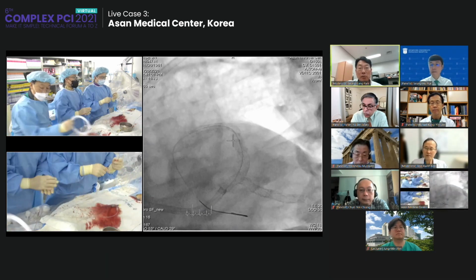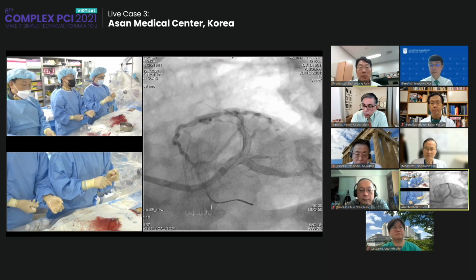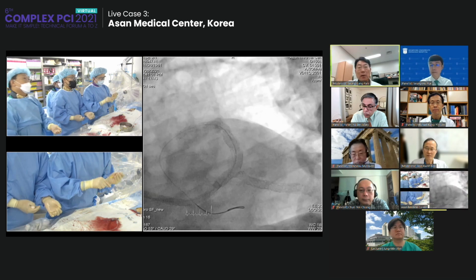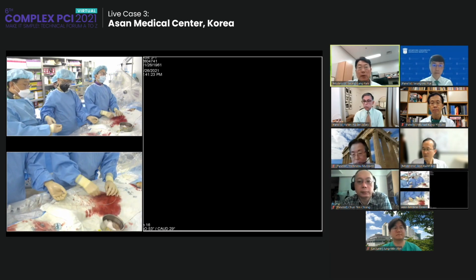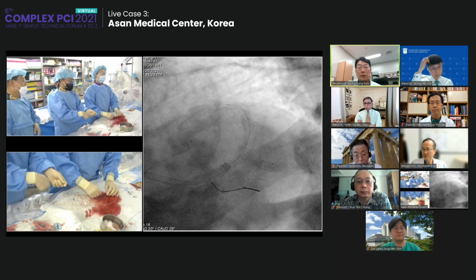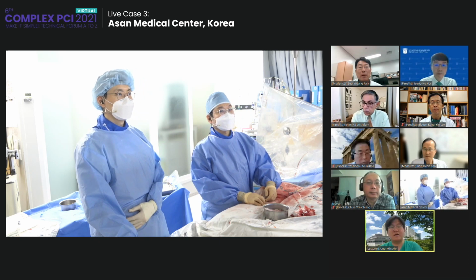Dr. Gang, would you do the rewiring? Yes, I rewire, and then the final kissing balloon, right? Yeah, that is the final step. We'll be back soon, after the final result in the cath lab. Dr. Gang? Yes, I already finished all my procedure.